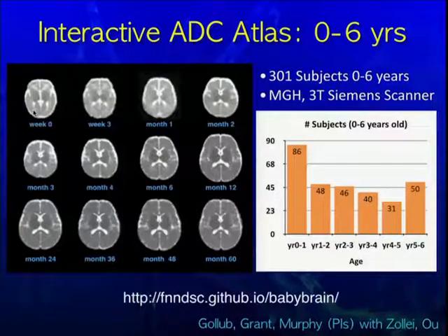These will eventually be posted on this interactive website here. Right now, all we have are volumetric T1s at birth, 6 months and 1 year that are normal, but it's going to have layered in there template maps plus multiple individual maps, so that the goal is to come up with a clinical assist. As you're reading your scans, you can pull up a website, and instead of a paper where they put 1 or 2 voxels and publish graphs of mean data, you'll be able to interact with the data set, put your cursor where you're looking, and see what the mean data is for the b-values that we use, which are going to be a b-value of 1,000, to collect these data sets.